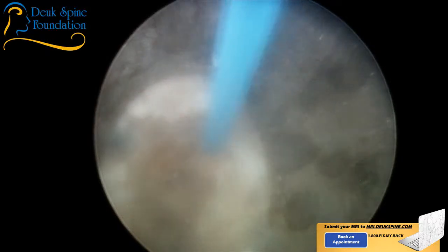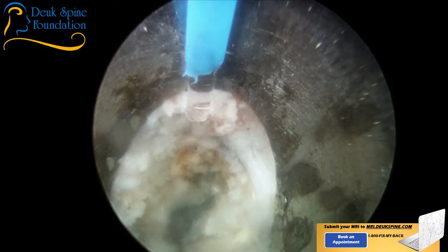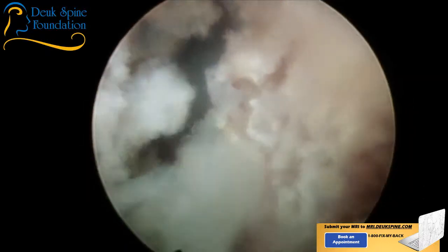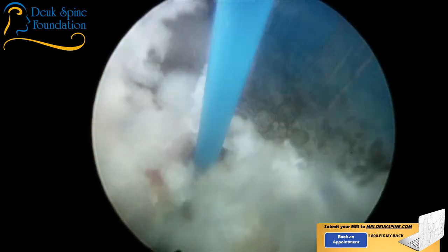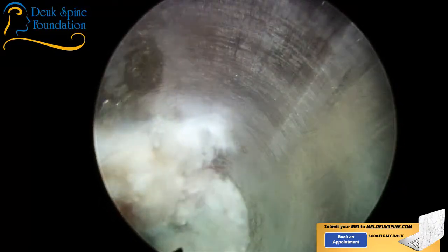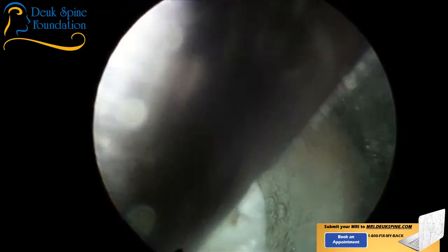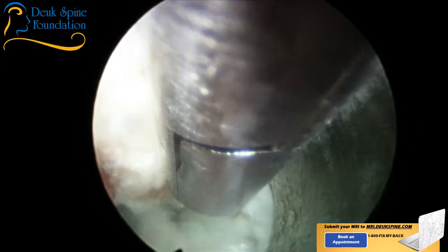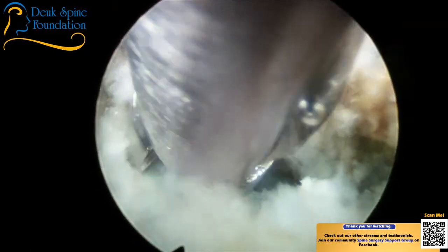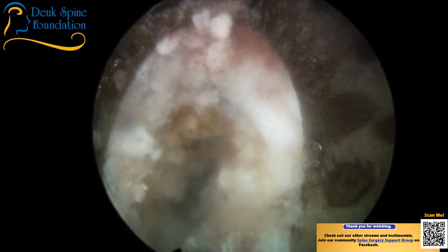That's just about done. I'll show you the L5 nerve root. This will be the right L5 root. It's just a lot of scarred up fat right there. All right. Yeah. Let me have a grabber. Take. See if I can grab that little hunk out. Take it. Oh, we're pretty much done.